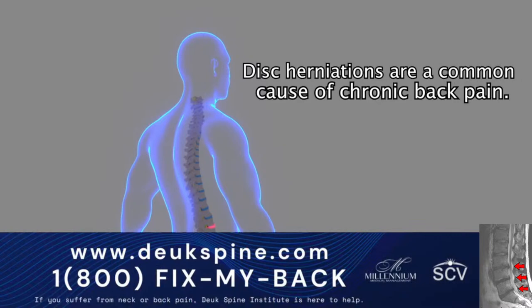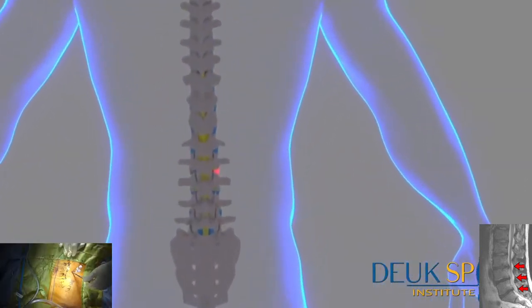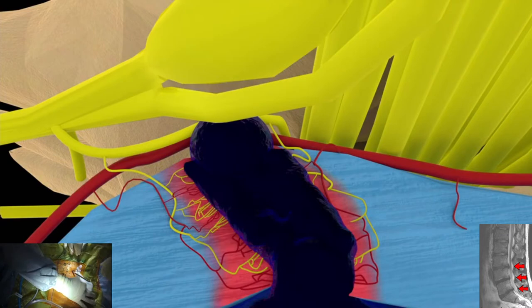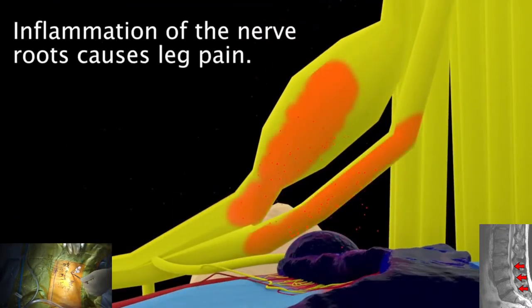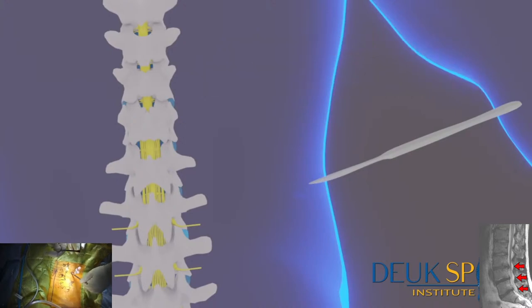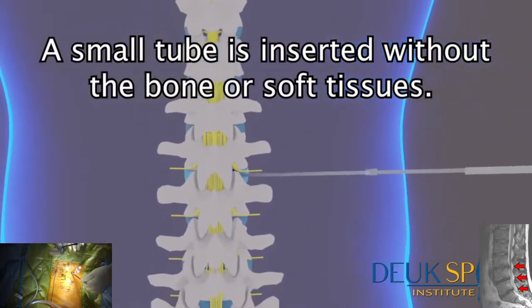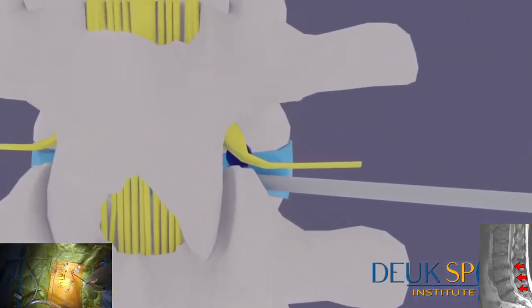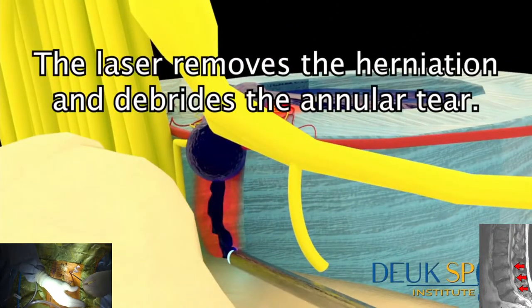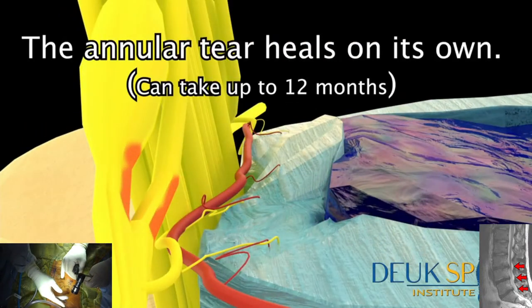Disc herniations are a common cause of chronic back pain. The inflamed annular tear causes back pain. Inflammation of the nerve roots causes leg pain. A band-aid-sized skin incision is made. A small tube is inserted without damaging the bone or soft tissues. The laser removes the herniation and debrides the annular tear. The annular tear heals on its own.